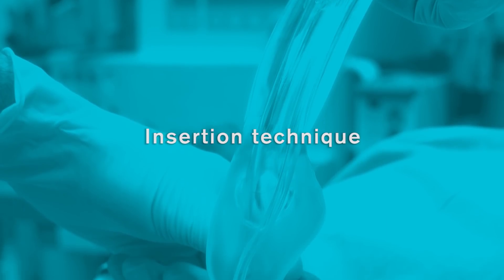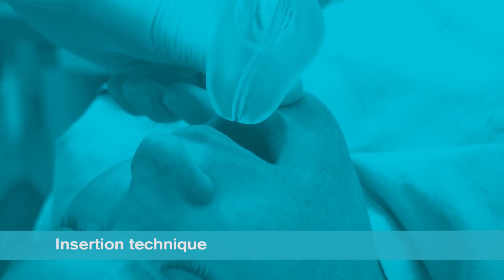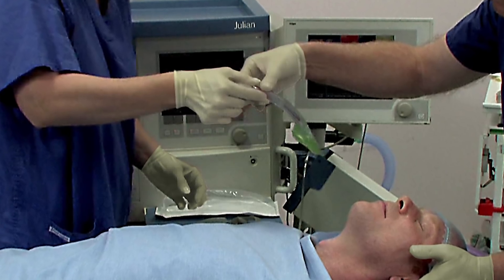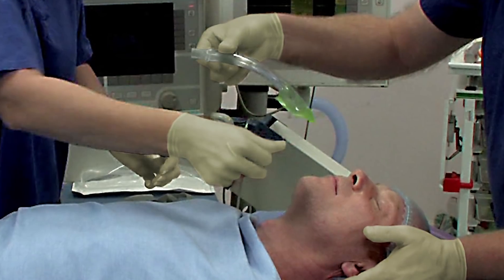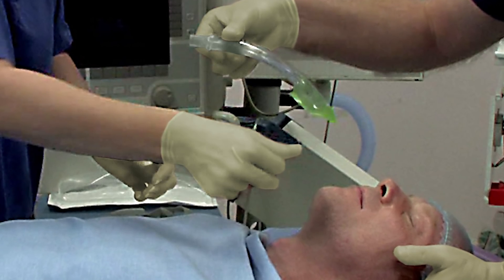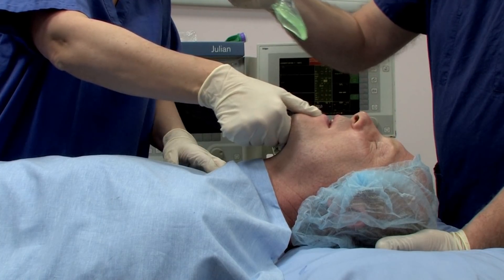Insertion technique. A proficient user can achieve insertion in less than 5 seconds. Remove the iGel from the protective cradle or cage pack and grasp the lubricated iGel firmly along the integral bite block. Position the device so that the iGel cuff outlet is facing towards the chin of the patient. The patient should be in the sniffing the morning air position with head extended and neck flexed, and the chin should be gently pressed down before proceeding to insert.